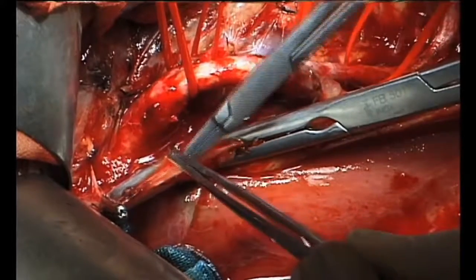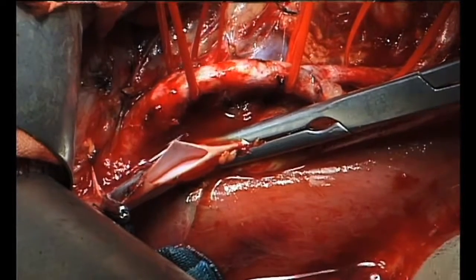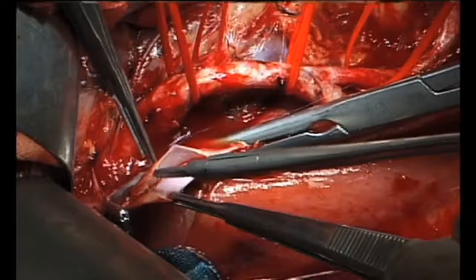The medial border of the caval rent is retracted by a 7-0 proline stay suture. A similar suture is taken in the upper angle of the rent, to be used later for the veno-venous anastomosis.